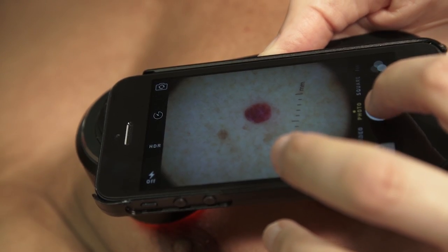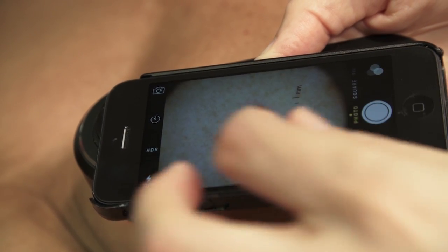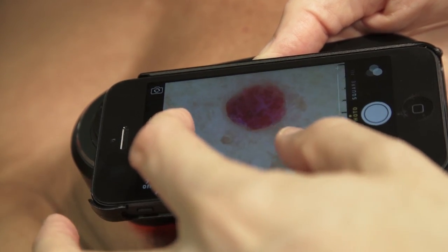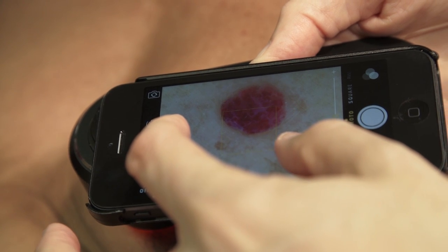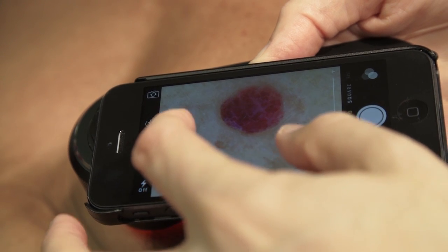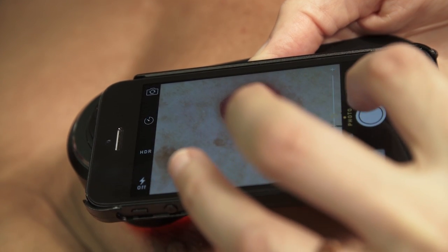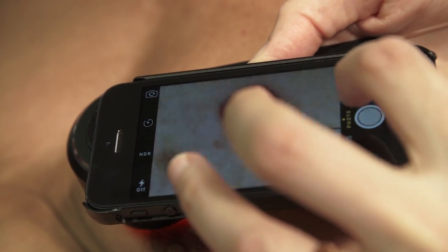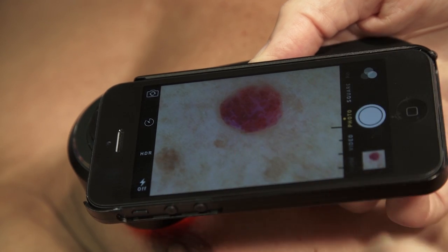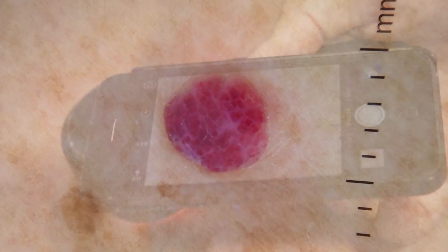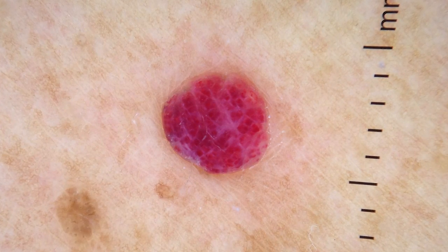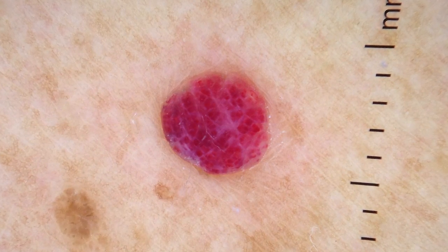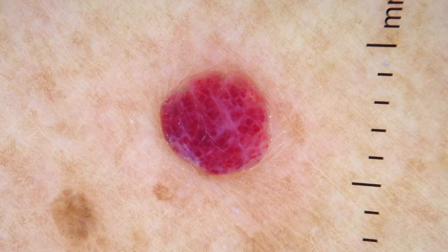Here we are demonstrating the dermoscopy of a cherry angioma. One of the advantages to using a smartphone is the ability to blow up the image before photographing it. This can help you see more detailed morphology.